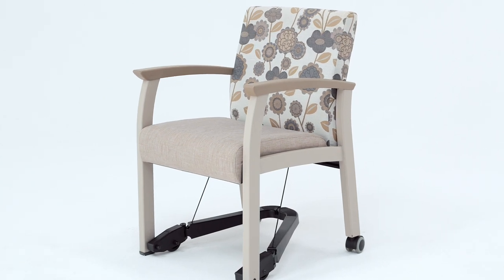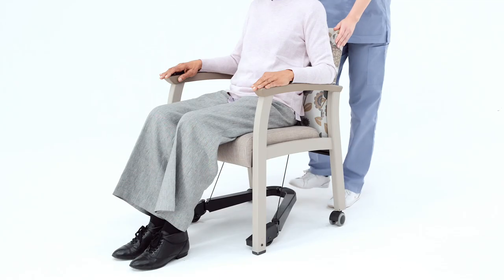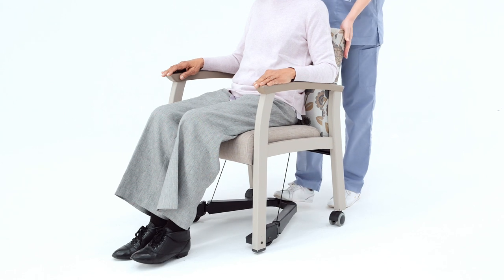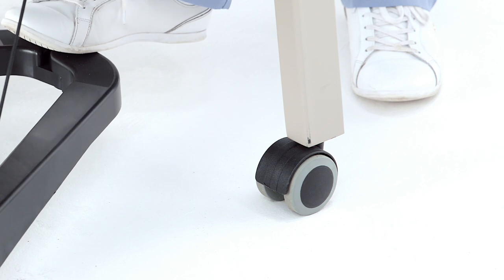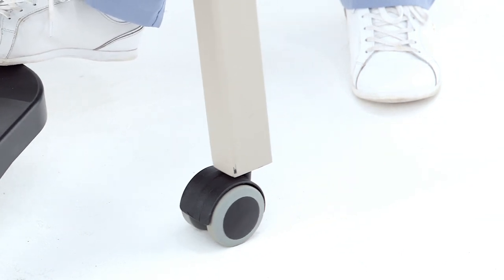The PrimaCare and Desmond HT dining chairs with lift enable caregivers to gently and effortlessly move a seated person to and from a table. Rear casters maximize maneuverability and ease of movement in tight spaces.